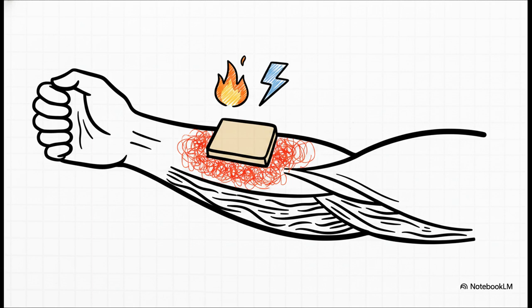Also, you should definitely warn your patient that they'll feel a stabbing or burning sensation. And you'll likely notice erythema, a reddening of the skin directly under the electrodes. Don't panic when you see that. It's completely normal reflex dilation of the superficial blood vessels.